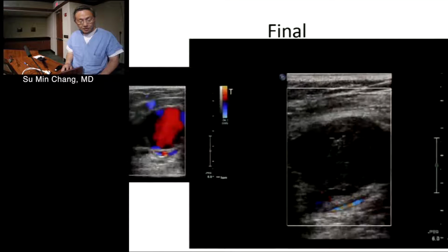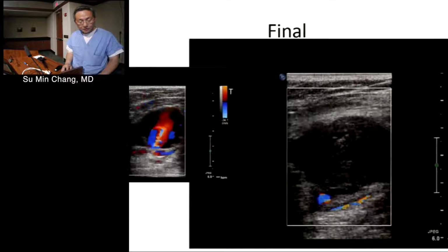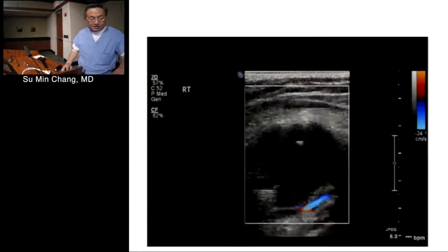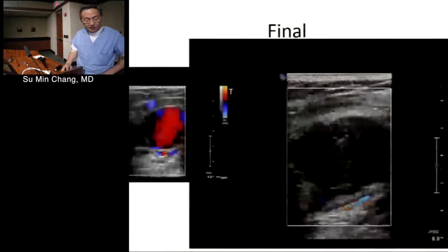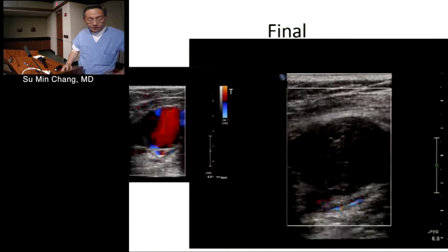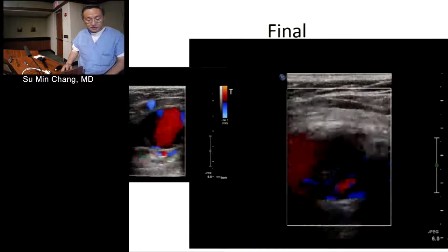Is there the same jet or no more? Well, on this last clip, I didn't see any. I see something there. Yeah, there's some blue here. That's right before, and then this is the final one. Did it just jet out there? No, they injected thrombin. Yeah.